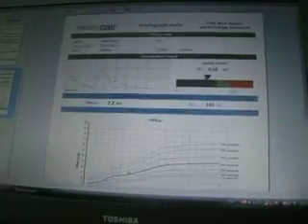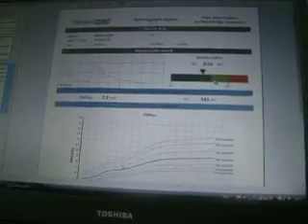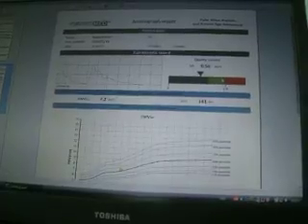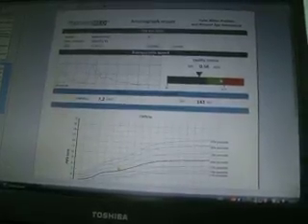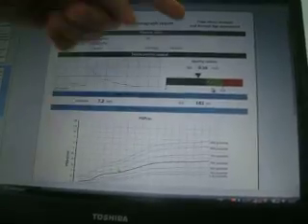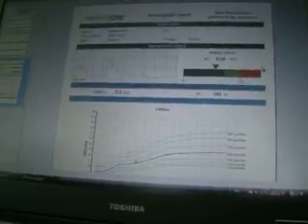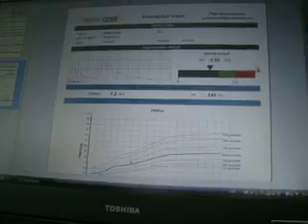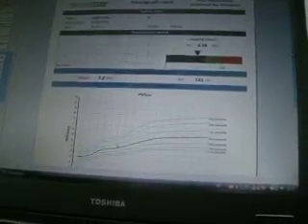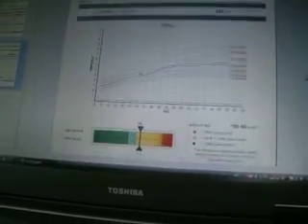The yellow area here would show you that next time you should be careful with that measurement, ensuring that there is no disturbance, no movement, and nothing that can affect the oscillometric measurement. If the quality control would be in the red field, it would automatically mean that you should repeat the measurement and reject the calculations from this measurement. Now we are in the green, so that's correct, that's perfect. Technically perfect measurement.